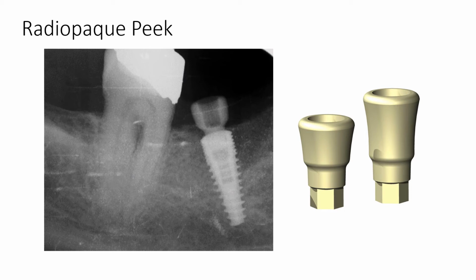So these abutments are very easy to use. They're pushed into position and then they're left and the soft tissue heals around them. They are not used in conjunction with any screw.